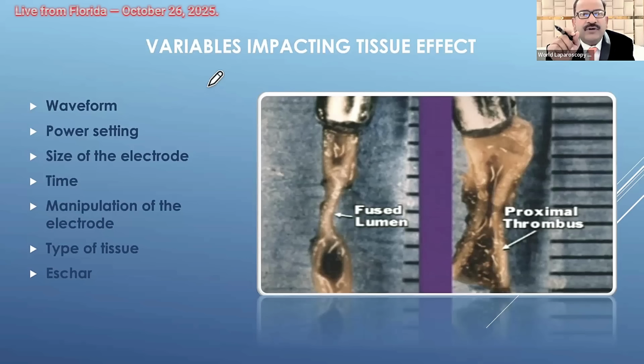Spray mode is also a type of fulguration. Then you are trying to coagulate the tissue, but it will not coagulate. The lumen of the artery will burst out and you will have more bleeding. In exactly the same way, you want pure cut and your machine was set to blend cut. So we should be careful that the correct waveform is selected.